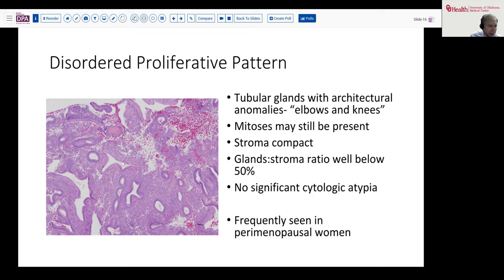Here we see these sorts of angulation, irregular contours, and a little budding — so-called elbows. You may see in this situation a little microthrombi and areas of stromal breakdown, because these are essentially anovulatory cycles or altered hormonal responsiveness of the glands and stroma.